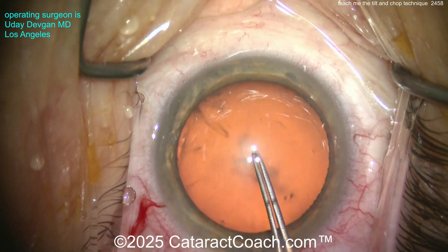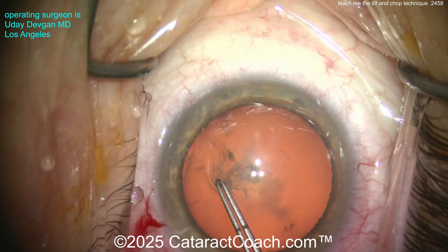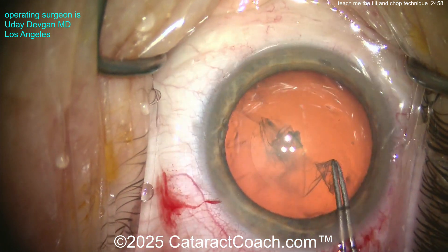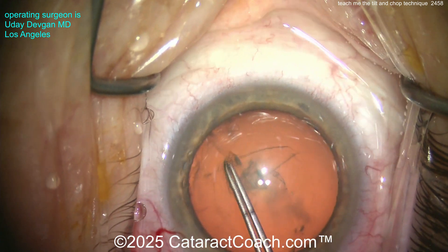A completely avascular incision I can open up five years later. Now using our forceps marked off at two and a half and five millimeters. The key here — if you want to do tilt and chop, you can't have a baby rhexis. You've heard Cataract Coach say it many times: no baby rhexis.